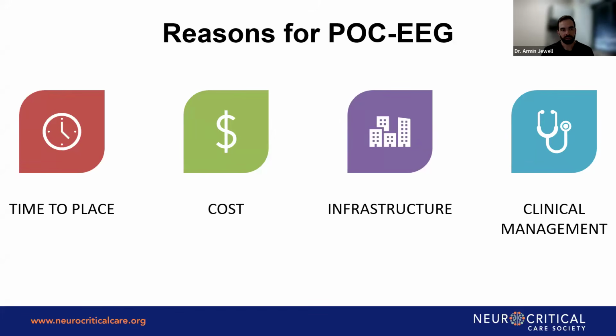So again, time to place seems like it would be shorter, given what we saw in the video also. In general, the cost is less because it has less infrastructure needed. There is, of course, disposable devices, but it doesn't need time for a tech. It doesn't need dedicated EEG machines. So the infrastructure is also smaller. And the idea is potentially more rapid clinical management. If we're able to get data from that point of care EEG faster, we're able to treat them more accurately and more quickly. So this seems like all very good things, but is this actually true?